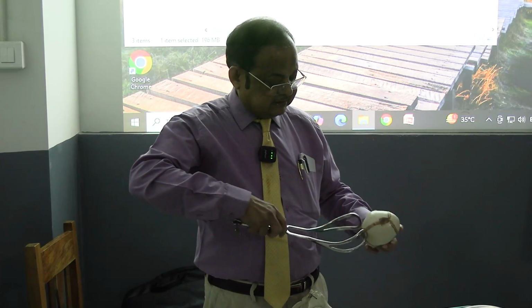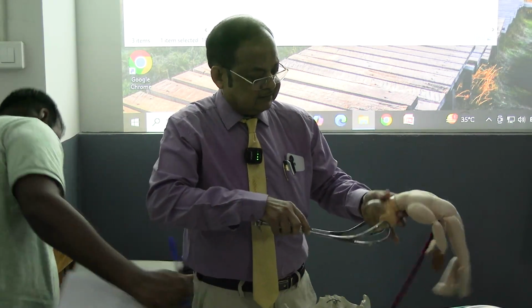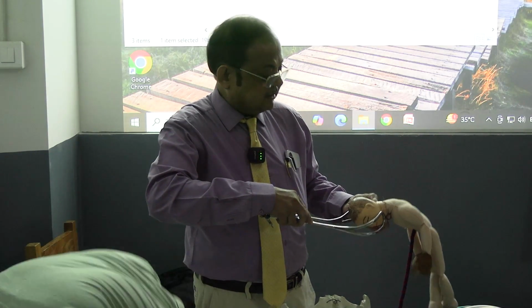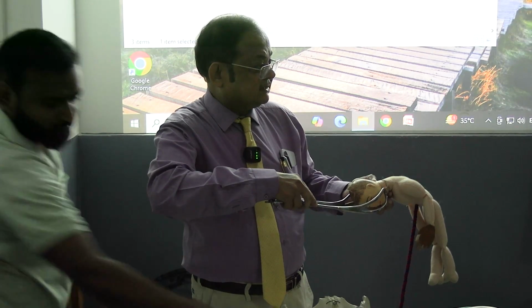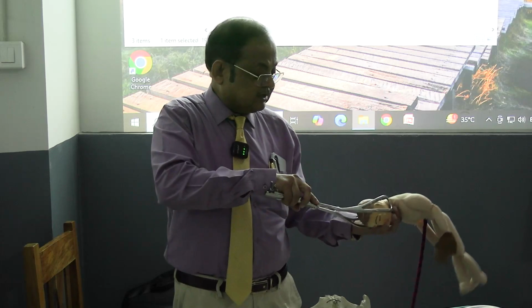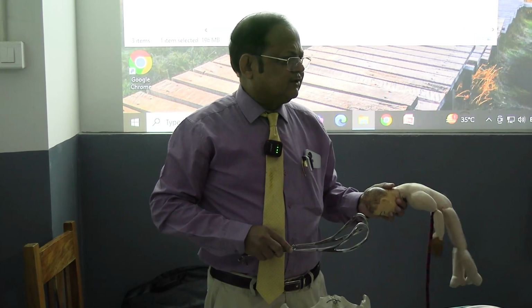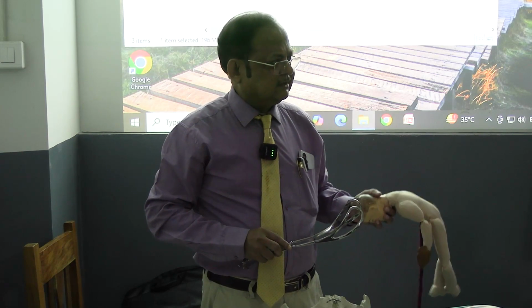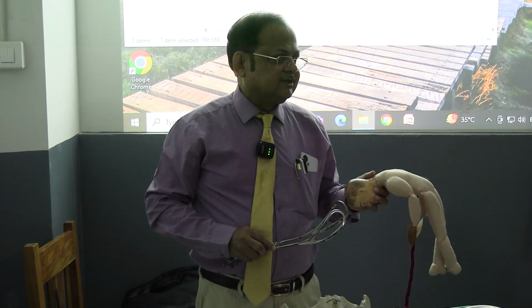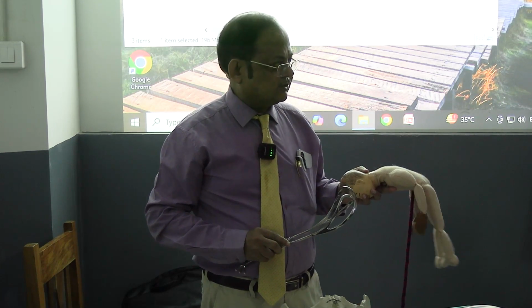This is called malapplication, and then you rotate. In case of low forceps or outlet forceps, this rotation can be done easily. But if the head is high up, particularly with mid forceps, for this rotation you need the rotational forceps, that is the Kielland forceps.